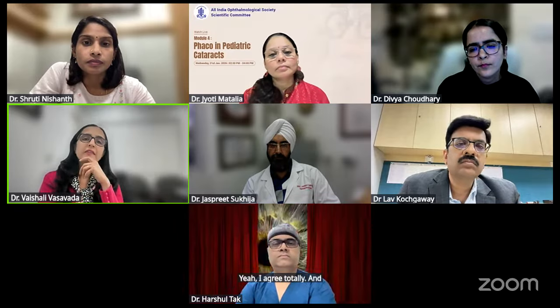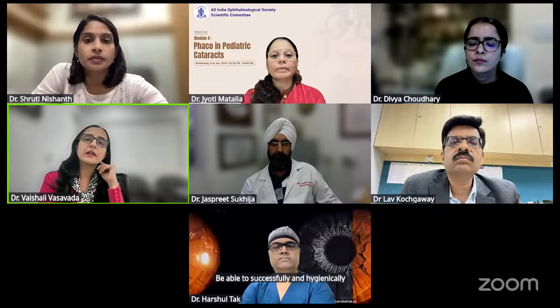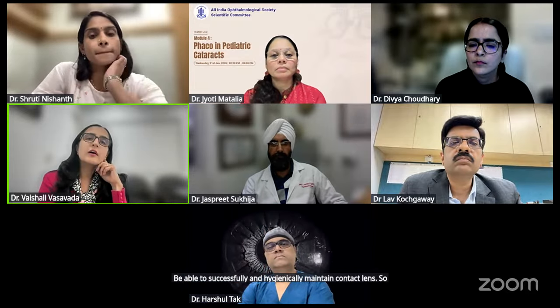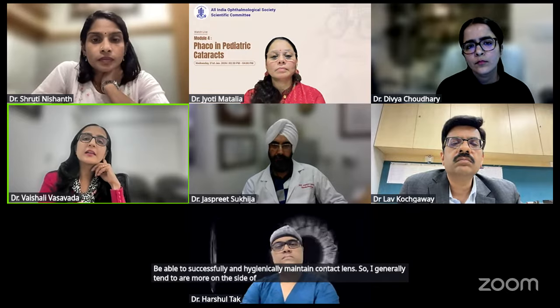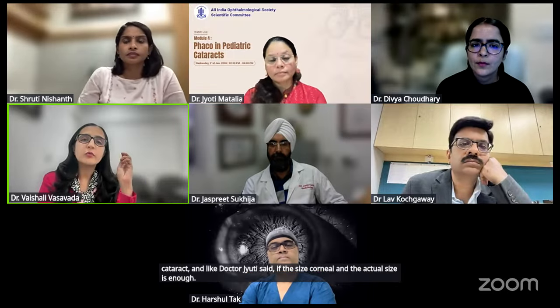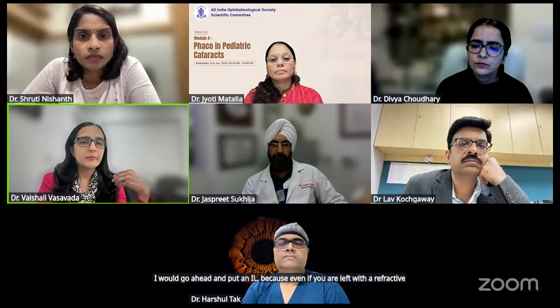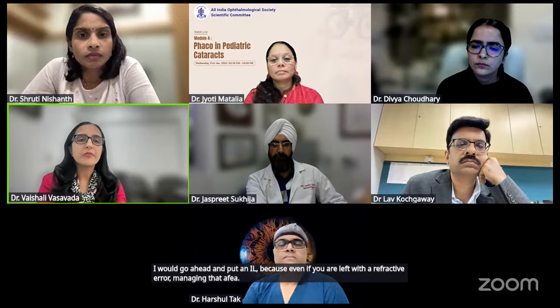Yeah, I agree totally. And like Dr. Jaspreet said, in our part of the country, it's not just the availability, it's more about the compliance, the ability of the parents to successfully and hygienically maintain contact lenses. So I generally tend to err more on the side of IOL, particularly if it's a unilateral cataract. And like Dr. Jyoti said, if the corneal and axial size is enough, I would go ahead and put an IOL, because even if you're left with a refractive error, managing that aphakia becomes very, very difficult.